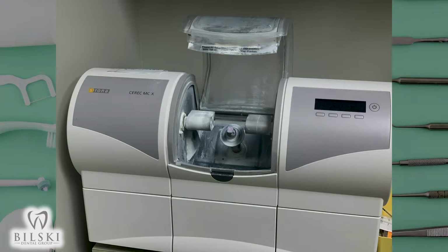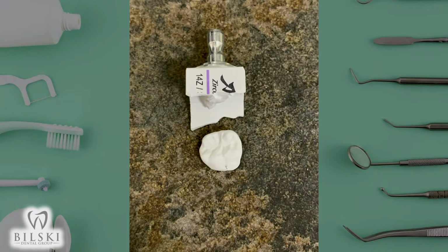There's a little block that gets inserted in the center there. And then there are two arms or hands, if you will, that have drills that just kind of reshape this little block that you're going to see right here. That is a zirconia block, which is one of the stronger tooth colored materials that we can use. And it mills that in about 15 minutes.